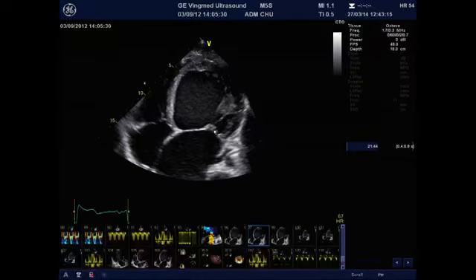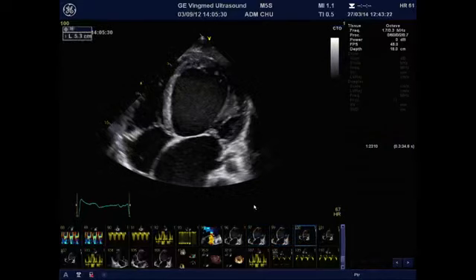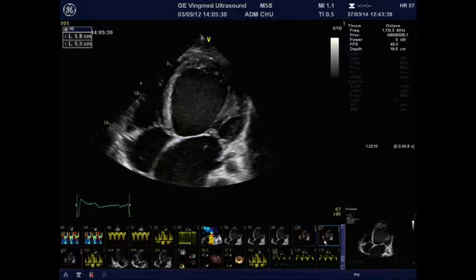It's a mixed pattern that could be seen in these patients with severe enlarged left ventricle. So what we should measure first is the diameter here. We measure it in mid-systole, often in this kind of patients, even if we can measure early diastole or late systole, but recommendation just says that we need to measure this in mid-systole. And you have to measure the distance between these lines traced here and the coaptation point. This is the coaptation distance.